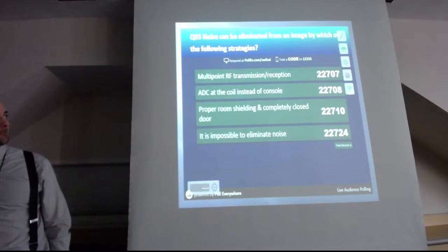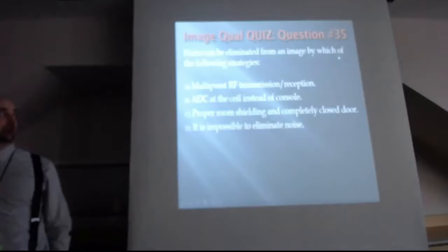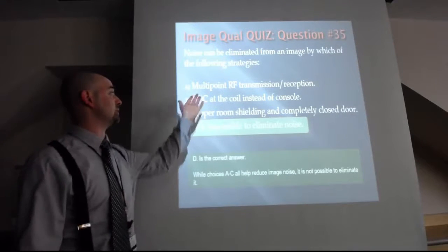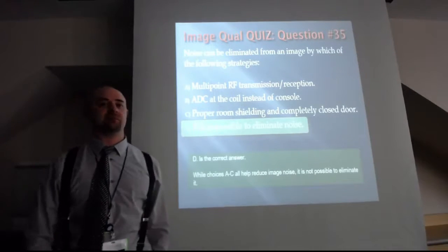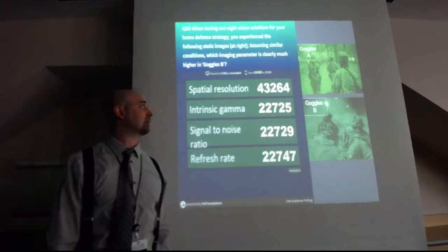Okay, good. So 100% of you correctly said that it is impossible to eliminate noise. So actually the first three choices all do reduce noise, or at least imaging artifacts. The first one reduces imaging artifacts. But the point is just so that you know there is no way to completely get rid of noise.